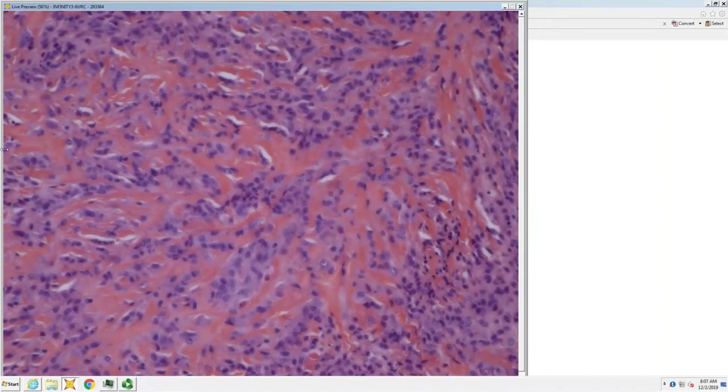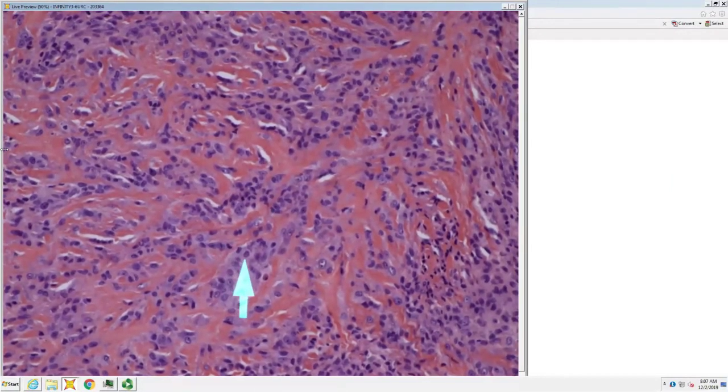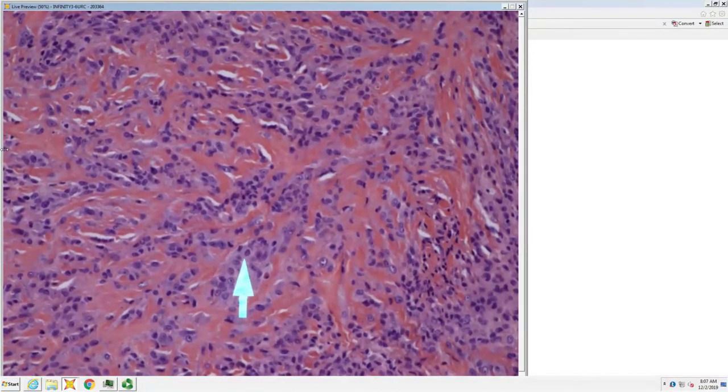Nodular fasciitis? Nodular fasciitis tends to have loose myxoid stroma and microvesiculation in the stroma. This has pretty sclerotic red collagen. It has the plump oval fibroblasts, lacks the giant cells, so just fibroma of tendon sheath.